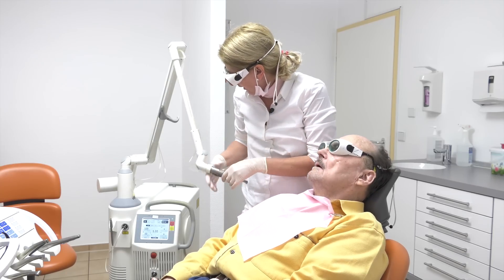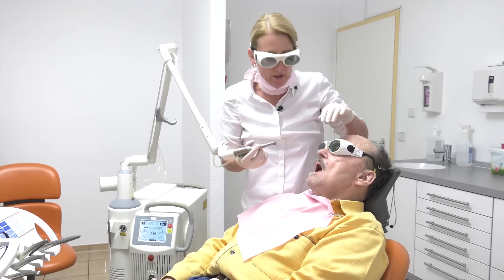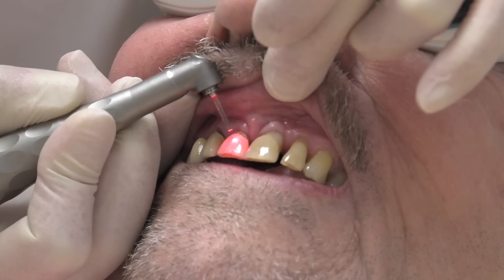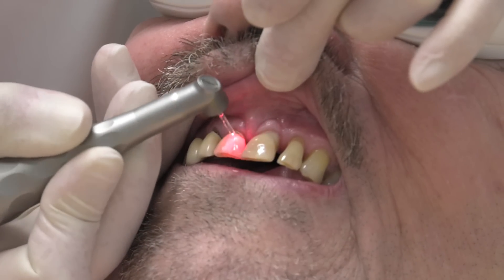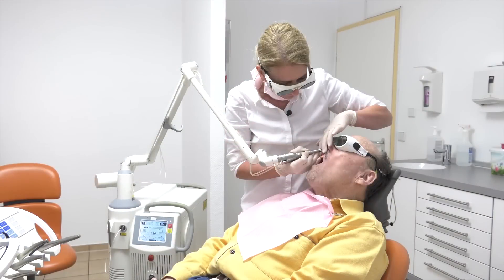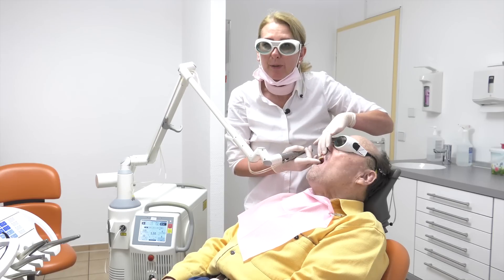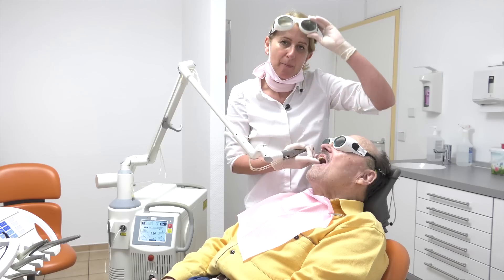You already know that the solid state laser works with 2,940 nanometers, and you do know that the absorption is in water. You can see how fast the laser works. We have finished the preparation, and I will start with the filling. We are back in a few minutes.